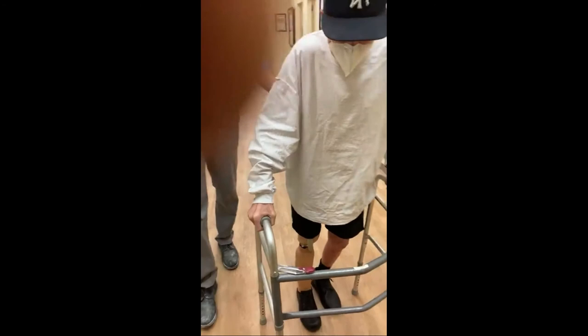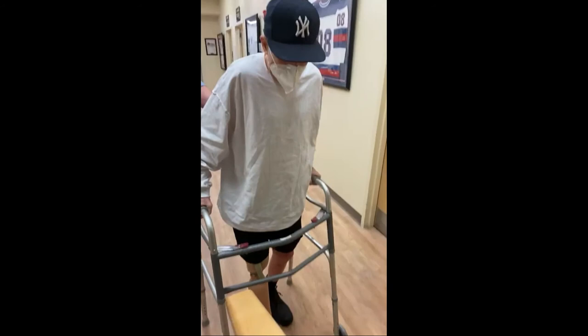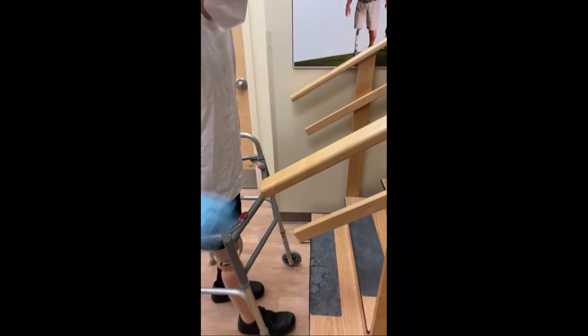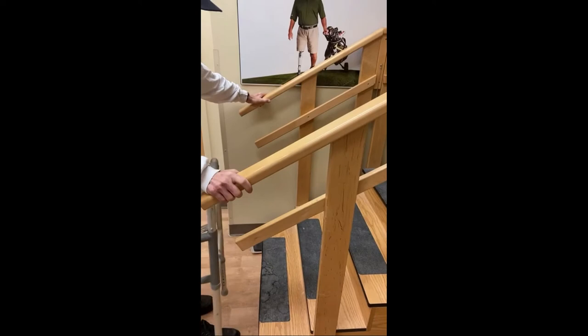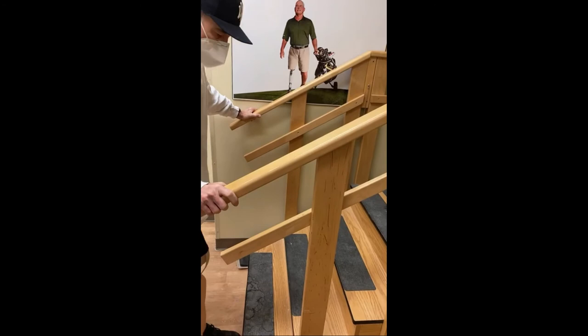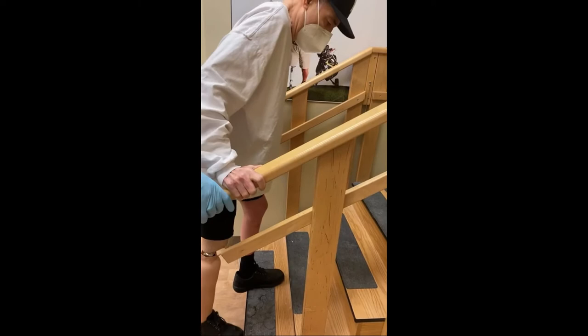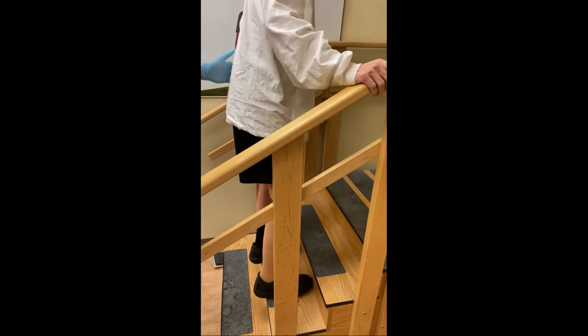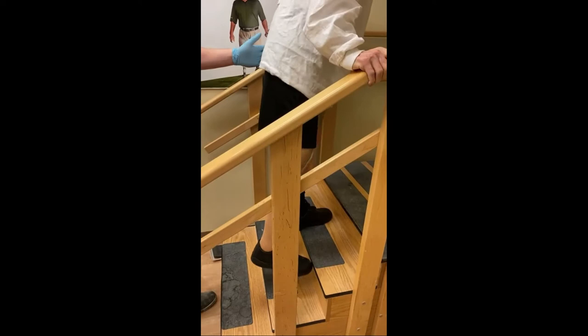Here are the stairs. We're going to hold on to the handrail. When we go up, it's up with the good. So we're going to take a step with the right. Step with the right, and bring your left foot up to that level. Good. Step with the right — oh man. Up with the left. Oh man. This is — I'm going to cry.